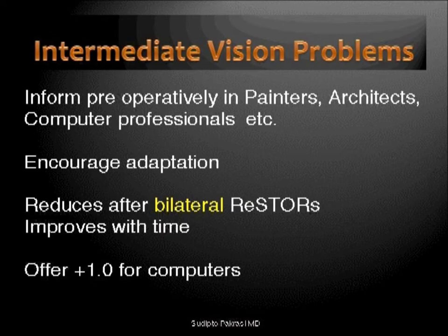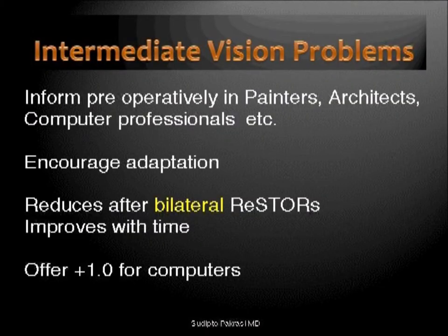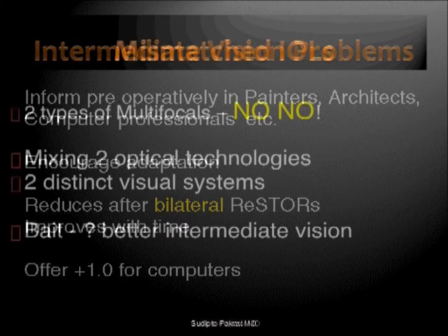And we have to be very careful about architects who want to see the maps and the stuff on the big table, or painters who operate with their long brushes, or people who work on laptops or screens, filmmakers. So we need to be careful about these people and counsel them very well, probably make them a bit more hypermetropic. I have been trying to make them about 0.75 hypermetropic in both the eyes, which will get a slightly better range of intermediate vision. It's a compromise, but it works.